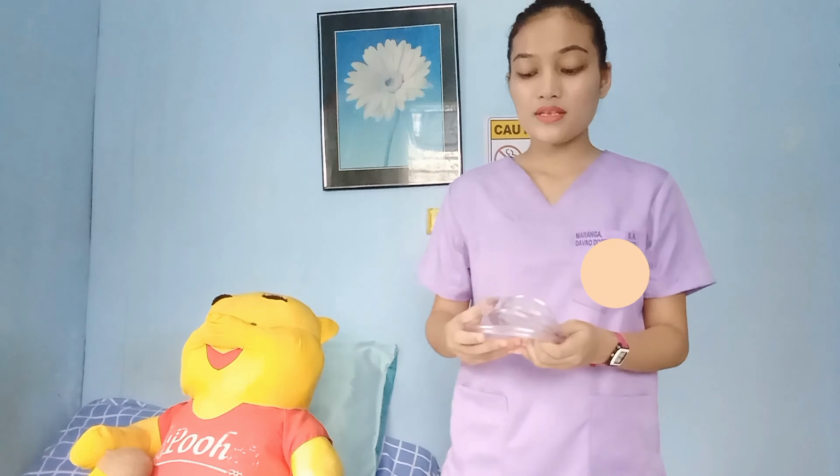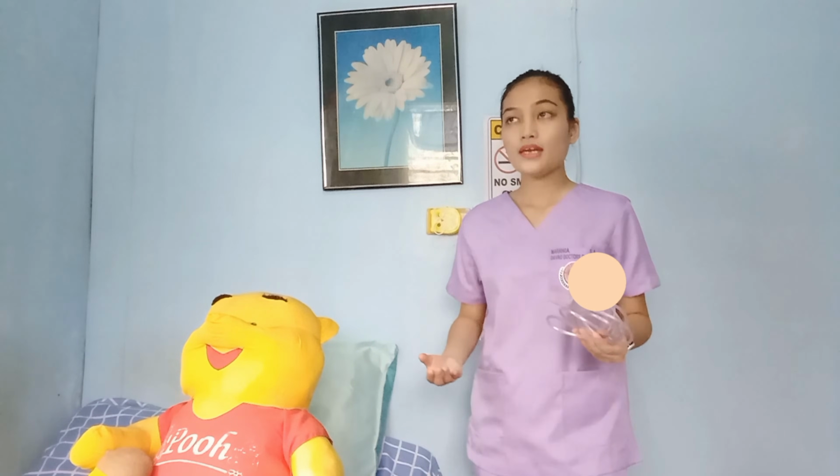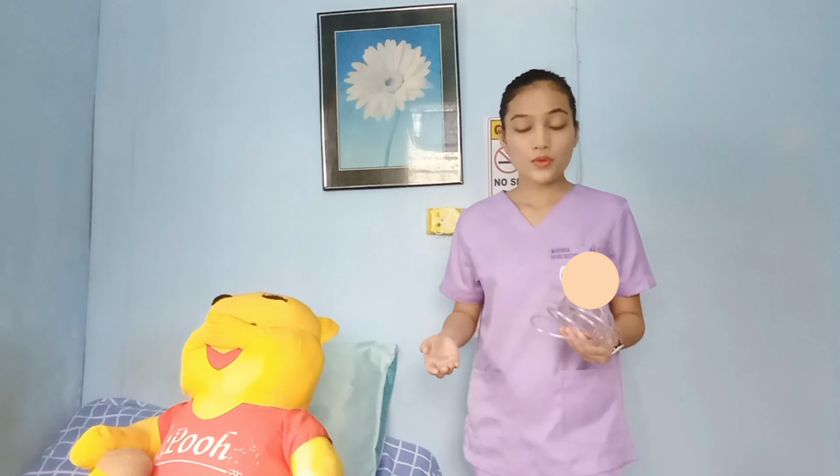Now, after doing that, I am going to connect my prescribed oxygen tubing and delivery device to the humidifier. There are a lot of types of oxygen tubing and delivery devices, but for today I'll be using the nasal cannula. This nasal cannula is the most common and inexpensive type of device used to administer oxygen. It is easy to apply. It does not restrict the patient's ability to eat or speak. It is relatively comfortable, it permits some freedom of movement, and it is well tolerated by clients.